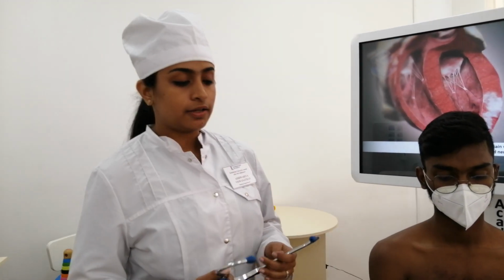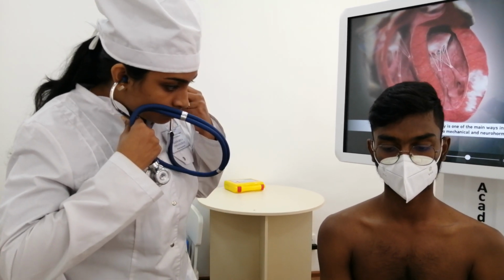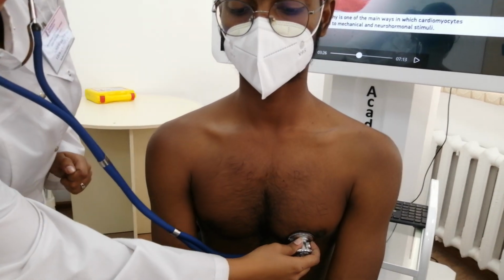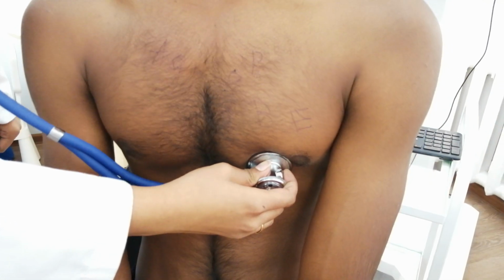There are totally 5 points. First is the mitral valve, which is present in the mid-clavicular line in the fifth intercostal space. Okay. We have to go 1.5 centimeter inside.